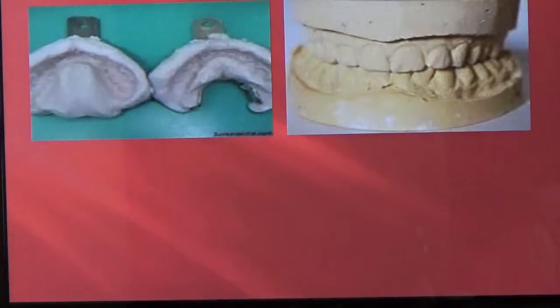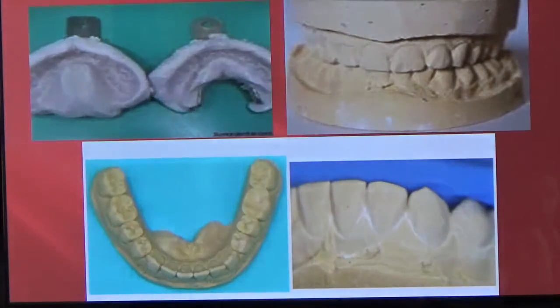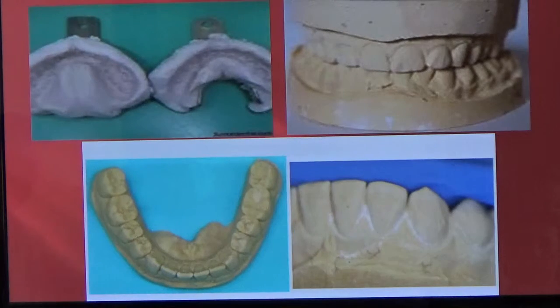Okay, so there are your alginate impressions. There you get your models. You kind of trim the model. This is what Dr. Cervantes is going to show you how to do. Make sure you don't have bubbles or anything here, because when you do your suck down, if you've got big bubbles, guess what? Your suck down is going to go around that bubble, and when you put it onto the patient or yourself, it's not going to go down. You want it down just to the gum line.